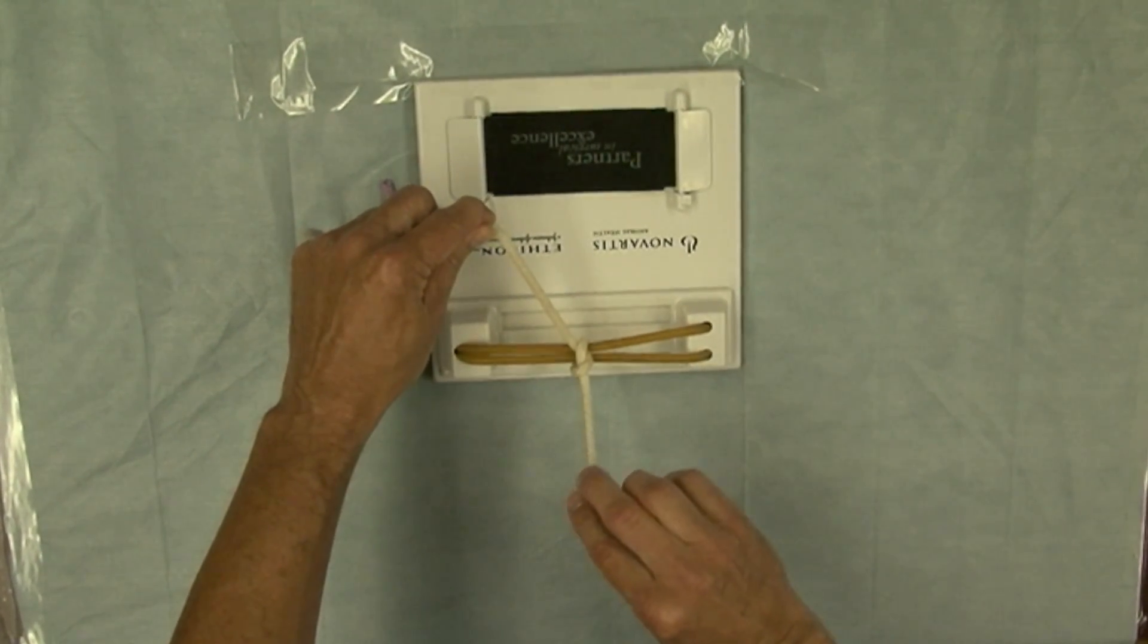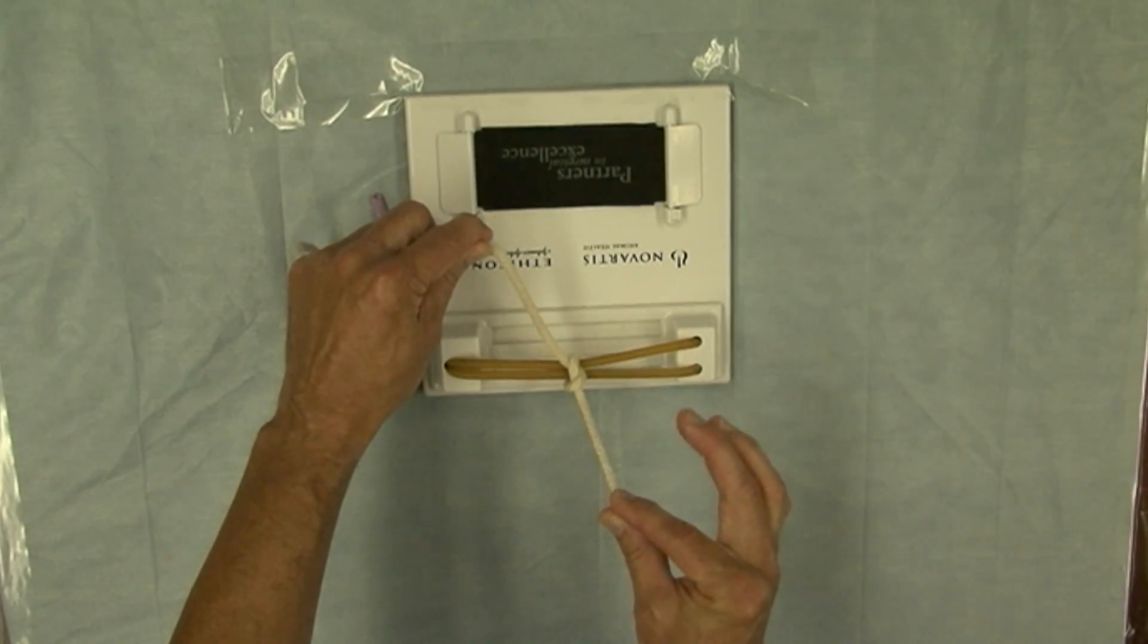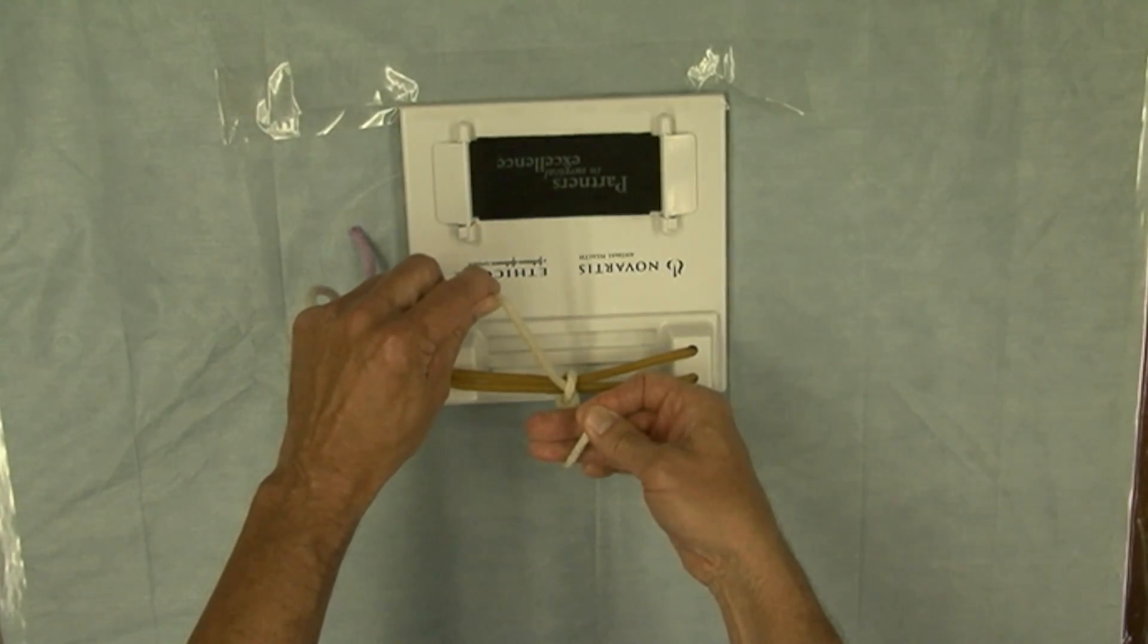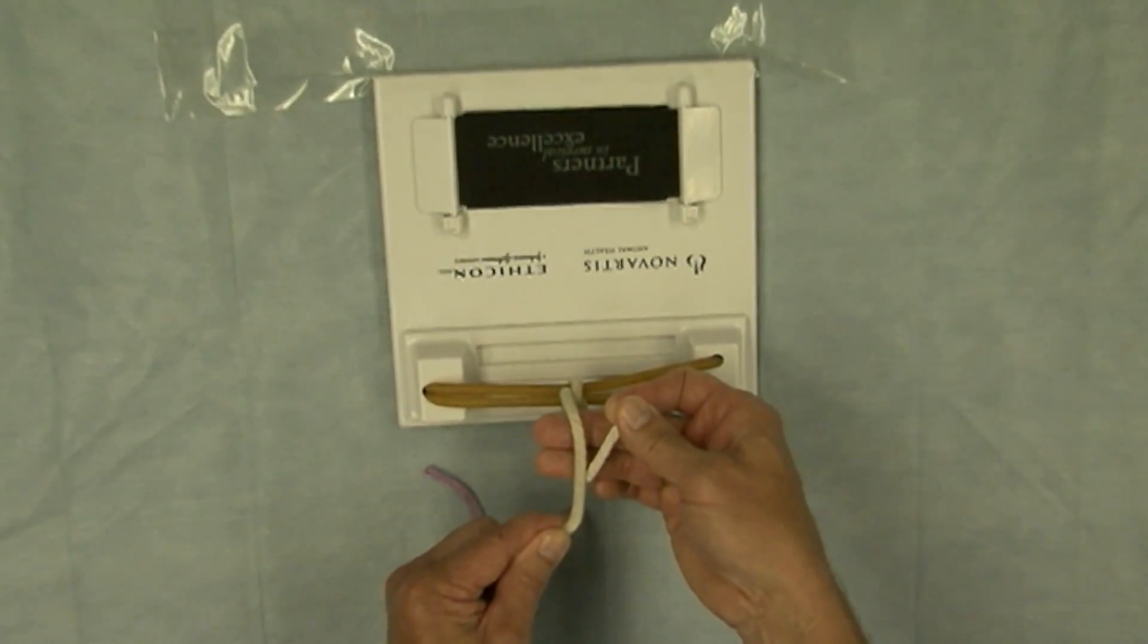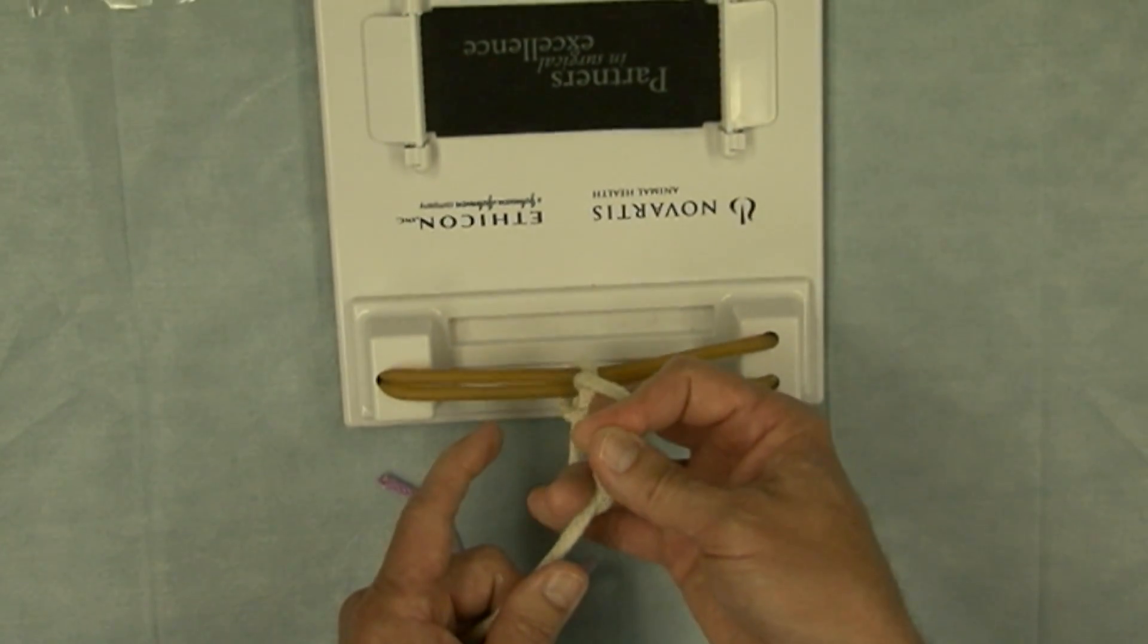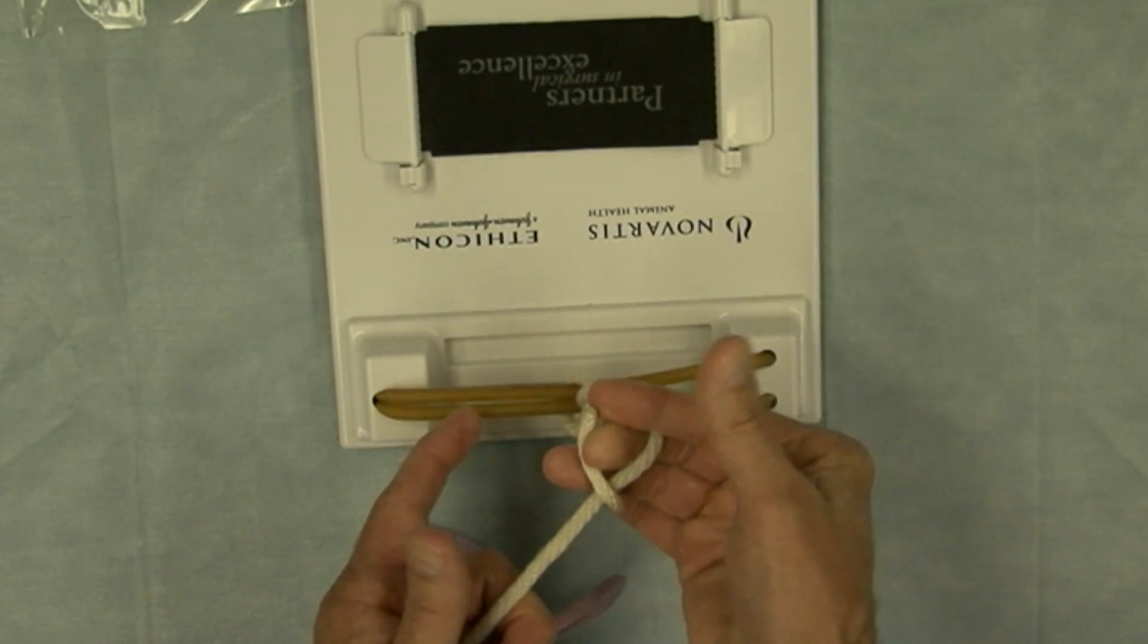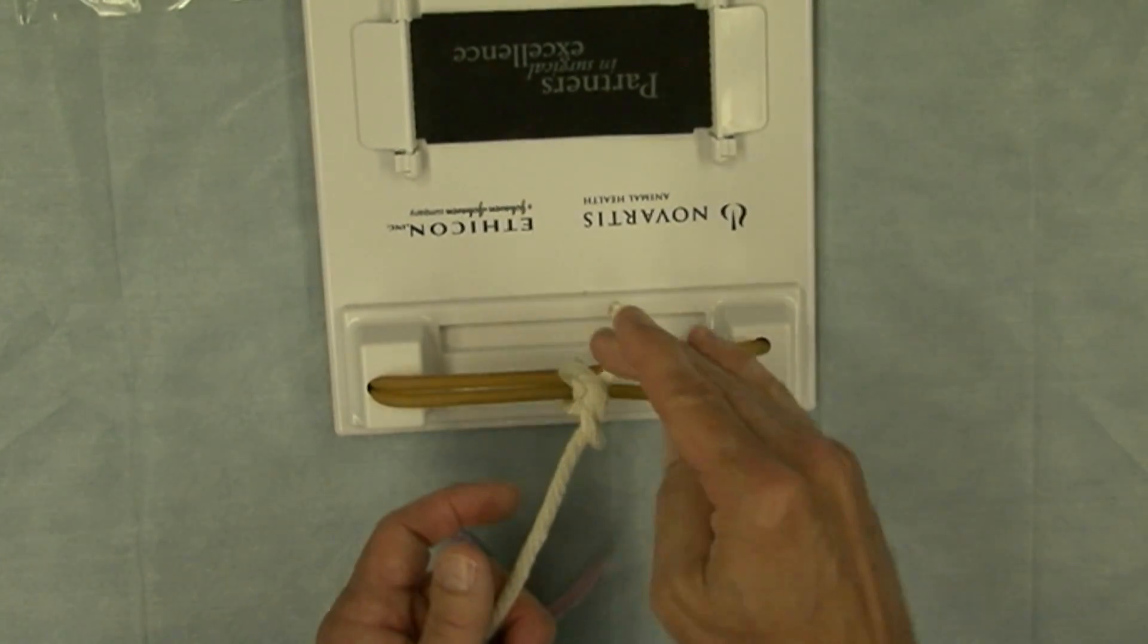Next I take the suture now in between the tips of my thumb and index finger, roll my middle and ring fingers around to create half a loop, complete the loop, and now I'm going to use my middle finger to go around, trap between my middle finger and ring finger the end of the suture, and bring it through the loop.